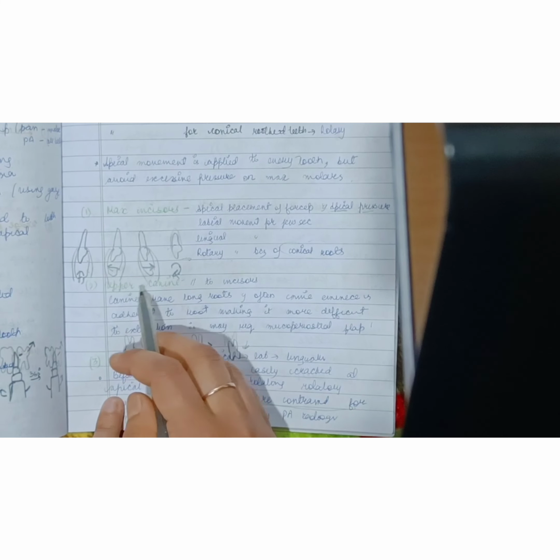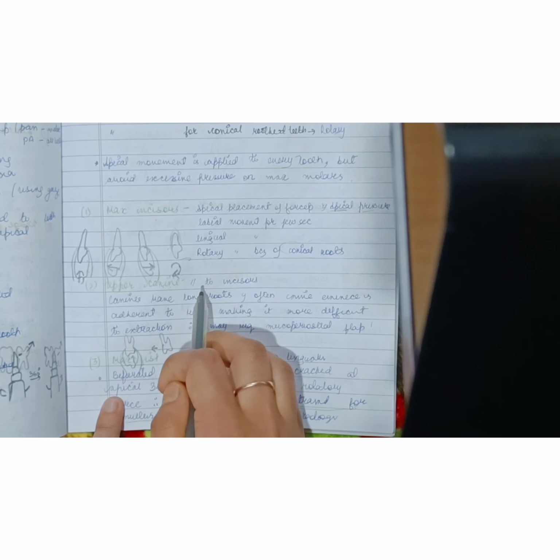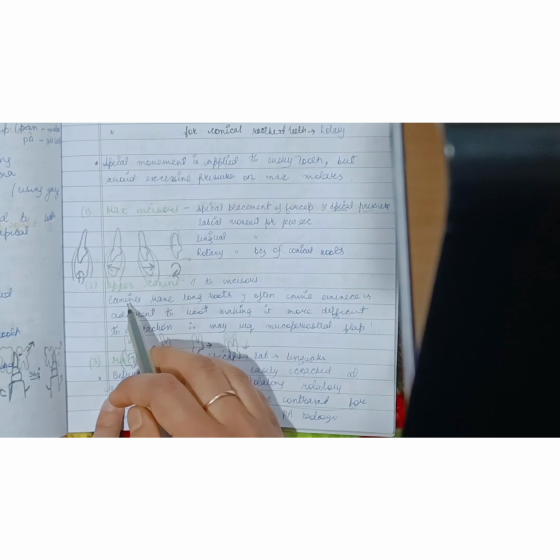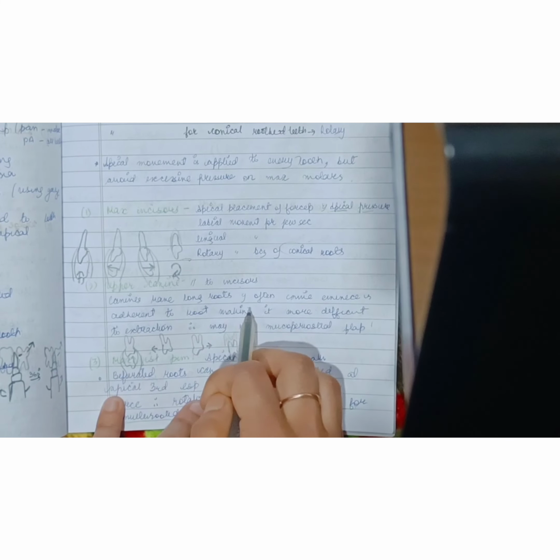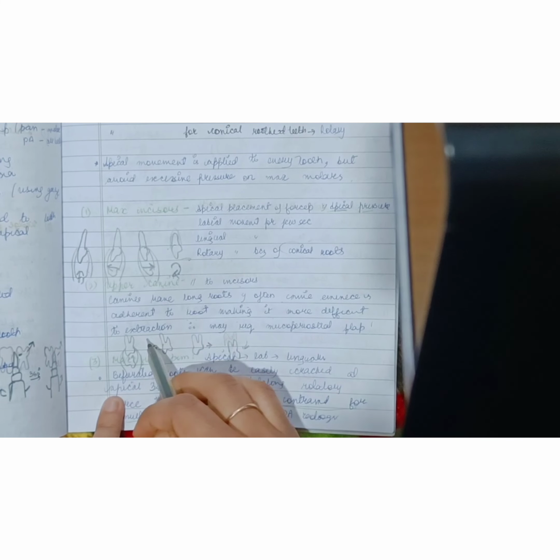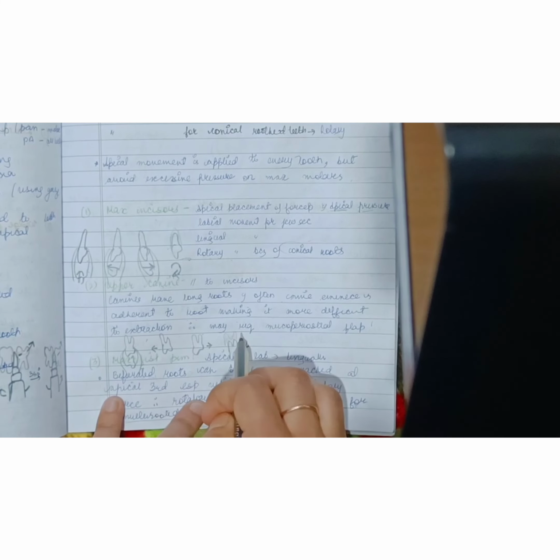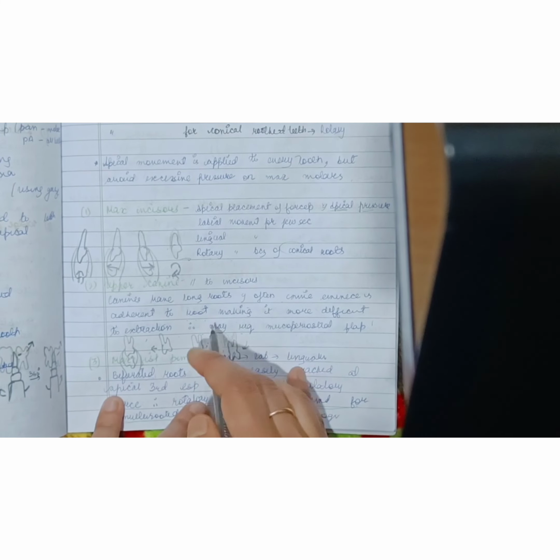Then the maxillary canines. The movement is similar to the incisors, but canines have long roots and often the canine eminence is adherent to the root, making extraction more difficult. Therefore, these often require mucoperiosteal flap elevation, that is, surgical extraction.